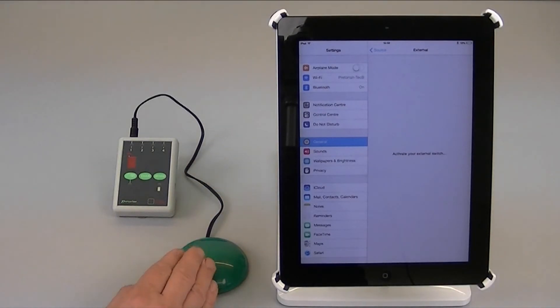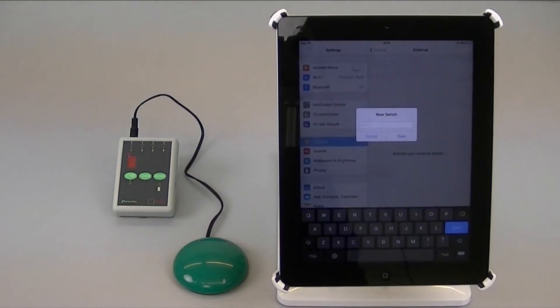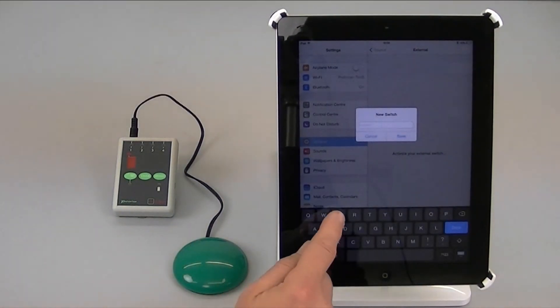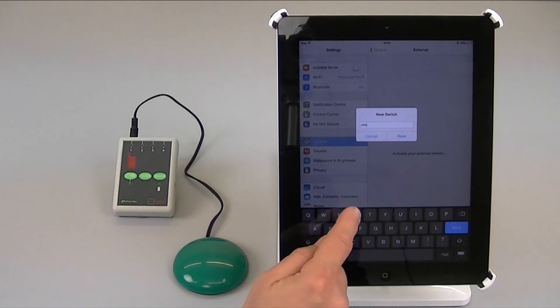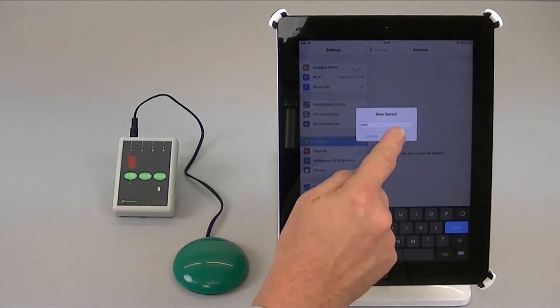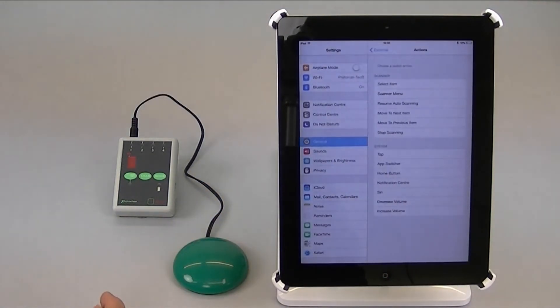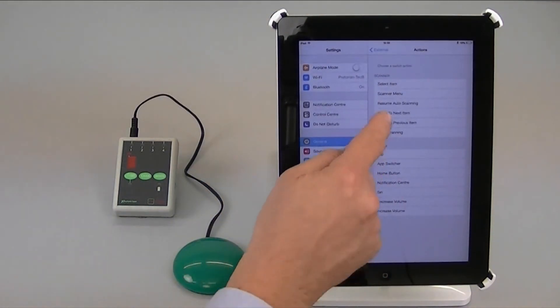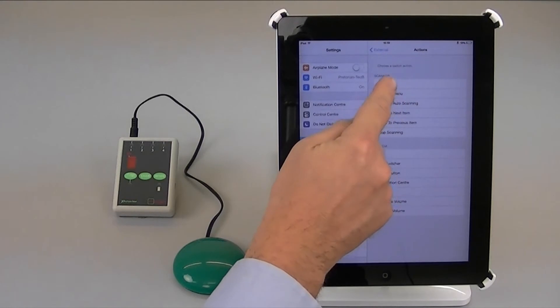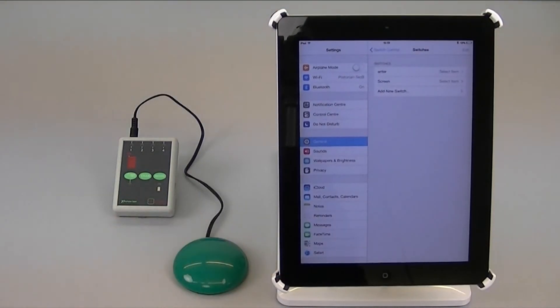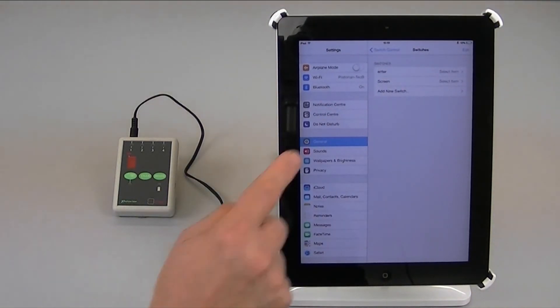So I press it briefly, it asks me to give it a name and as usual I'm going to call it enter, save, and as before for auto scanning I would set it to select item and there it is on the screen already.